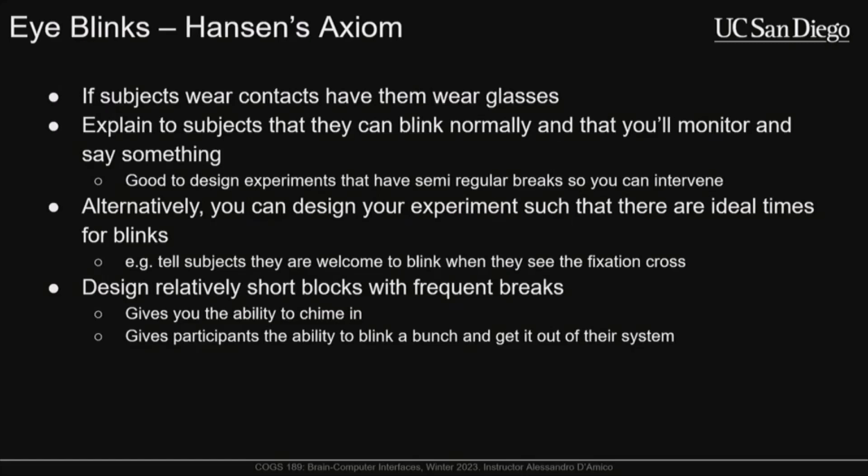So this was actually in all of our protocols at my old lab, and I still use it to this day. There's this whole script that you tell subjects about what to do, and before we start recording, we'll show the subjects the raw EEG data as it's coming in real time, and we'll tell them, okay, go ahead and blink once for me, and they'll blink, and you see this massive thing. Even though the subjects are not trained to collect EEG, even though they don't necessarily understand what's being shown to them, it is very obvious to them when they see the blink that, okay, wow, that is a huge signal. And even children are very receptive to this, and you can tell them, okay, you see that? That's really bad, we don't want that. And they're like, okay, yeah, for sure.